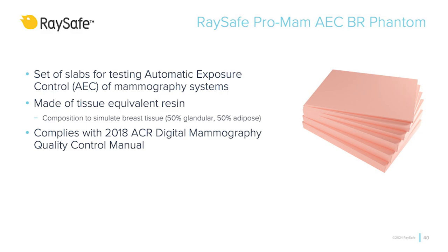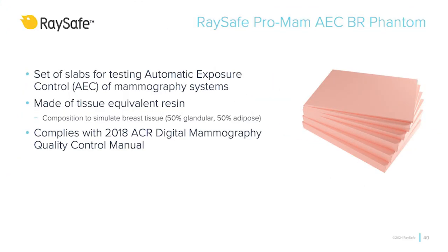The RaySafe ProMam AEC BR Phantom is used in mammography quality control, specifically for testing the automatic exposure control feature. AEC ensures the correct exposure for the best image quality while minimizing the dose to the patient. The Phantom is made of tissue equivalent resin, simulating the X-ray attenuation of actual breast tissue. It mimics a balance of 50% glandular and 50% adipose tissue, important for accurate AEC adjustments.